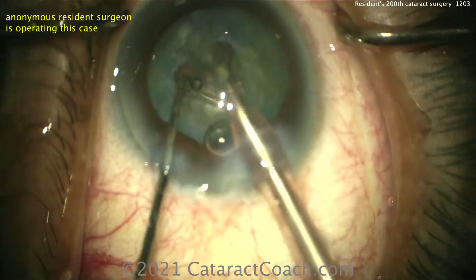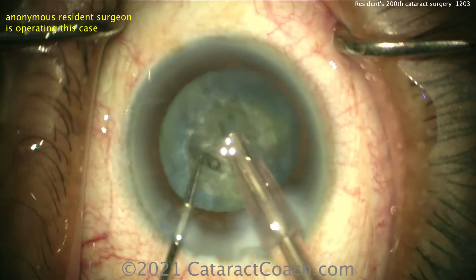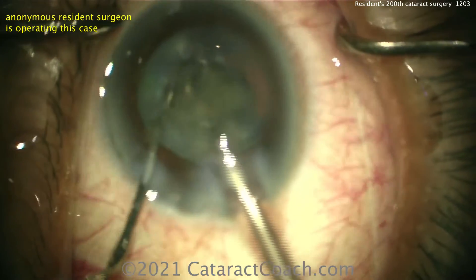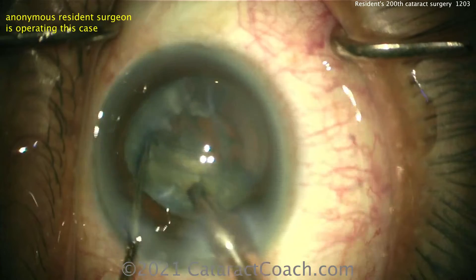Let's look around the eye — good draping, all the lashes are out of the way, the lid margin looks pretty well sequestered, tear film looks good, no oily secretions. Good job. For 200 cases, you're doing a fantastic job here.